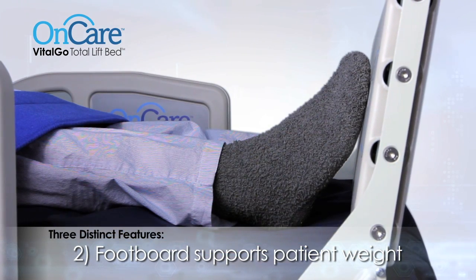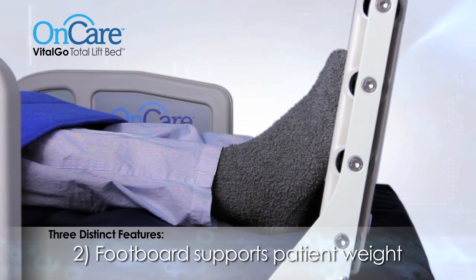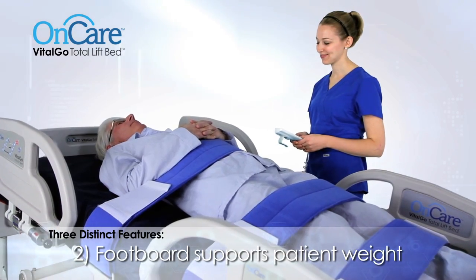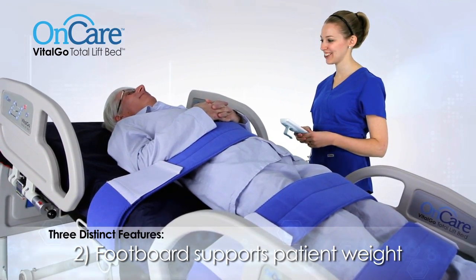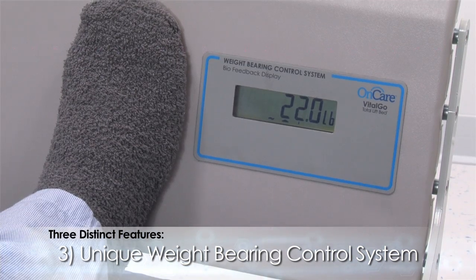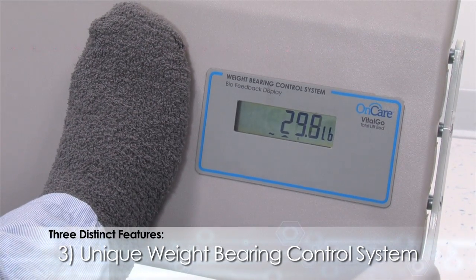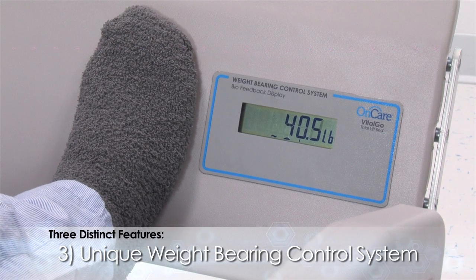Second, when tilting is engaged, the patented footboard moves up to meet the patient's feet, achieving a safe and secure tilting position while supporting a patient's weight. Finally, the Total Lift Bed features a unique weight-bearing control system. The integrated footboard scale gives caregivers a unique ability to accurately measure patient weight-bearing ratios.